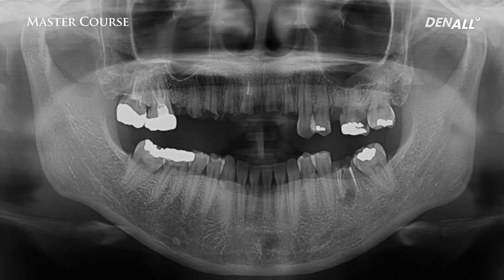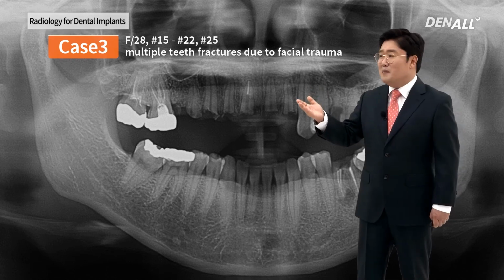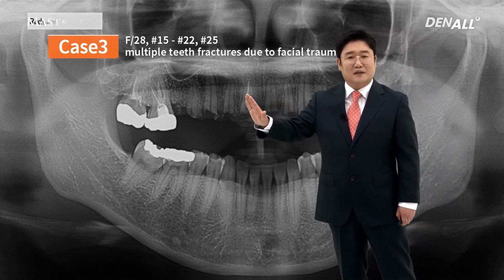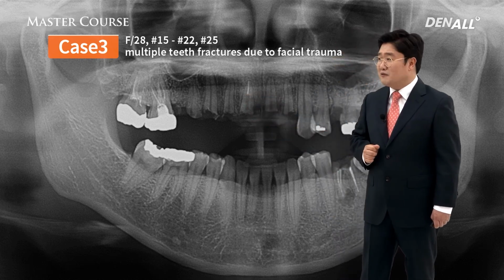In this patient, a young female patient who received facial trauma, so many teeth were destroyed. Implant will be placed after the extraction.